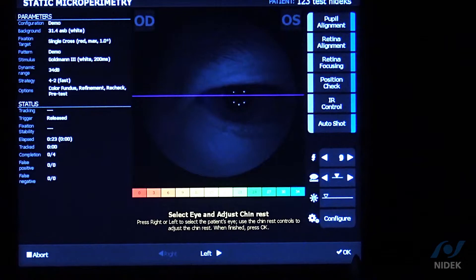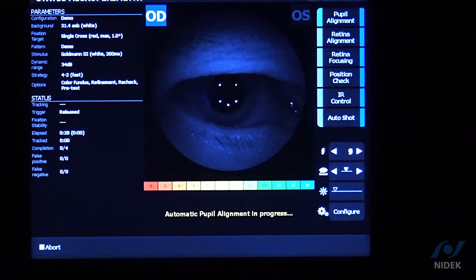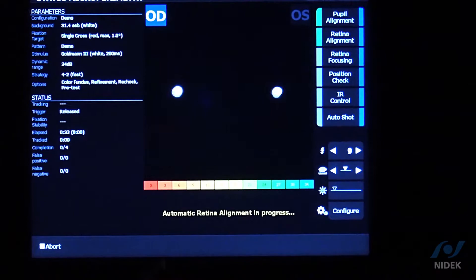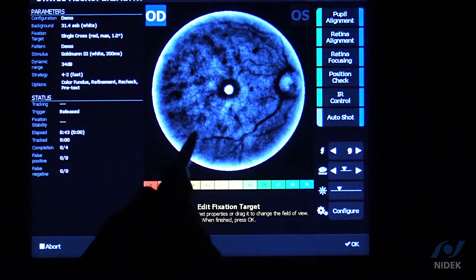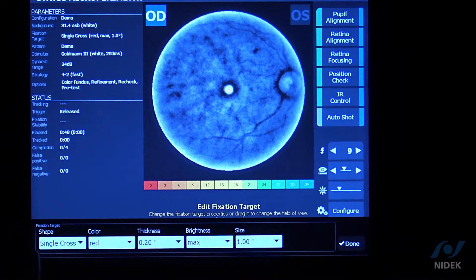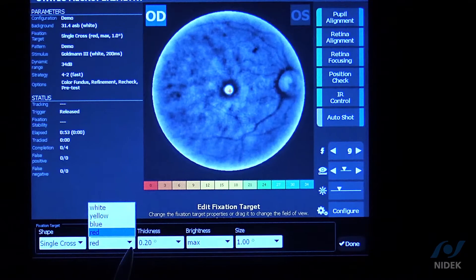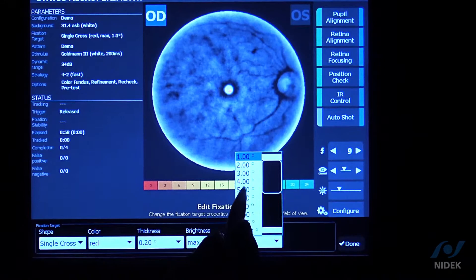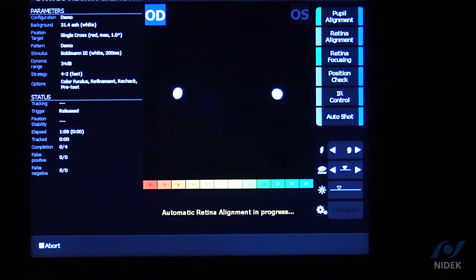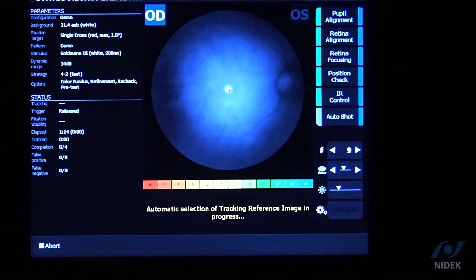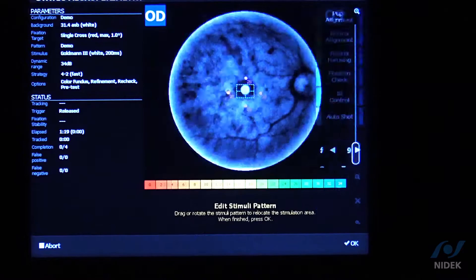Select OK and have the patient open as wide as they can, because we want to see those six white focusing dots. We're going to focus onto the retina using infrared light. At this point I can move the fixation target — if the patient can't see it, we can change the size and shape under Configure. Clicking Configure lets you change the shape to a circle, four crosses, or four lines; change the color, thickness, brightness, and size. For example, selecting five degrees makes the fixation target larger for the patient. Once finished, click Done and then OK. At that point we look for a tracking reference — the MP3 utilizes the whole 45-degree infrared fundus image as the tracking reference.